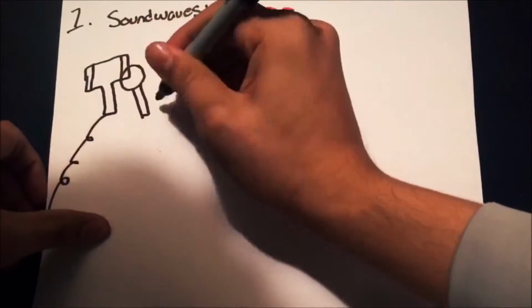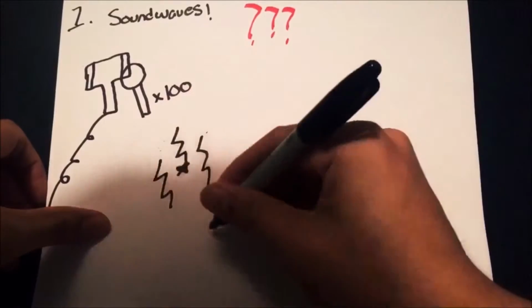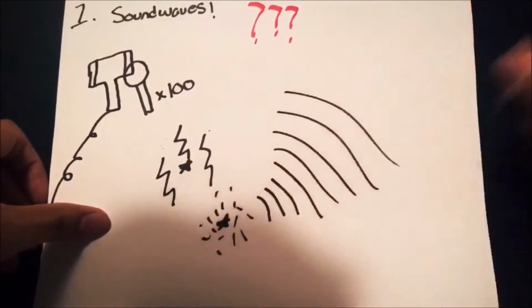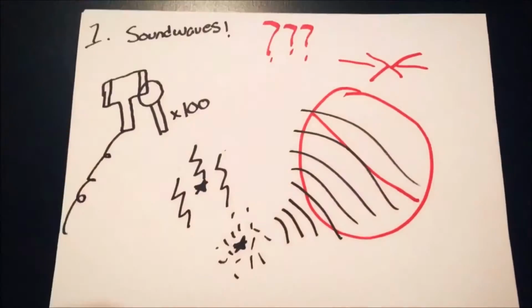In the transducer head, there is a crystal. Here, the piezoelectric effect will convert electrical energy to acoustic energy. An electric current will make the crystal expand and contract at such a rate that it begins to vibrate and form mechanical waves. But these waves can't travel through space like electromagnetic energy. Instead, it relies on absorption and molecular collision.